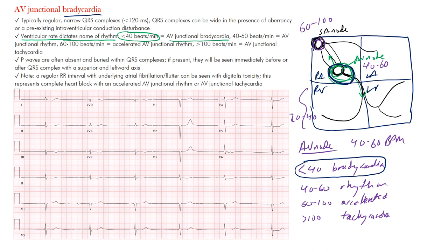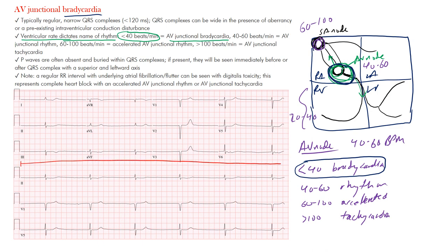When we talk about AV junctional bradycardia, we're saying that we have a rhythm originating from the AV junctional area with a rate less than 40 beats per minute. What you'll see on the EKG is a slow rate. Obviously, you don't have those normal P waves preceding the QRS complexes. Notice there are no P waves before each of these beats. They're quite slow. To calculate the ventricular rate, from beginning to end is 10 seconds; multiply by 6 to get 60 seconds, which is one minute. Count the complexes and multiply by 6 to get the rate in beats per minute.